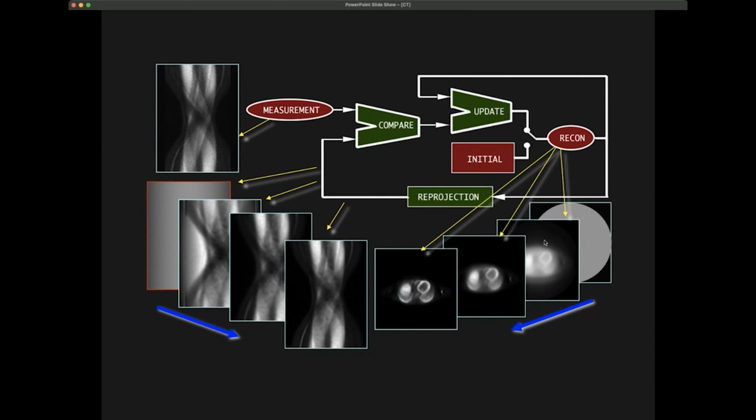Okay, so now we had two ways of reconstructing our data. One is pure back projection, where we smear out the measured projections from all directions, and then we have a smoothed version of the image, but this gives us an image. The other one is where we use the projection theorem, where we know that there's a relationship between the Fourier transforms of the projections and the Fourier transform of the original image, of the original distribution. That is the basic principle of that reconstruction.